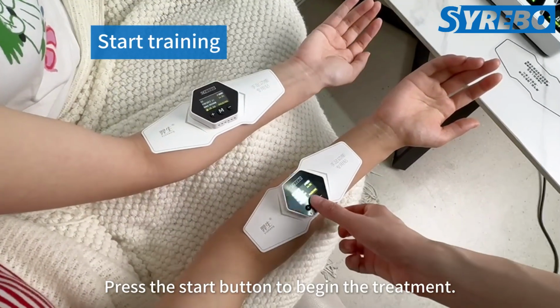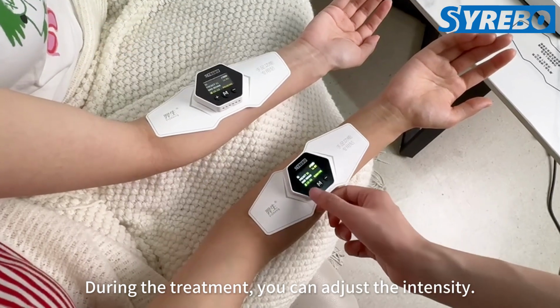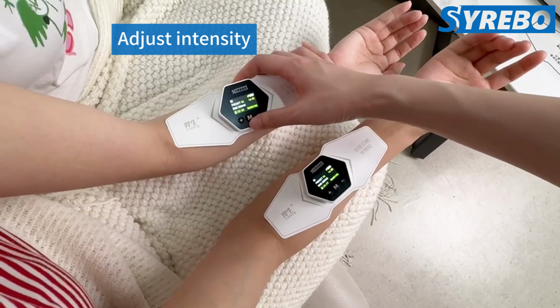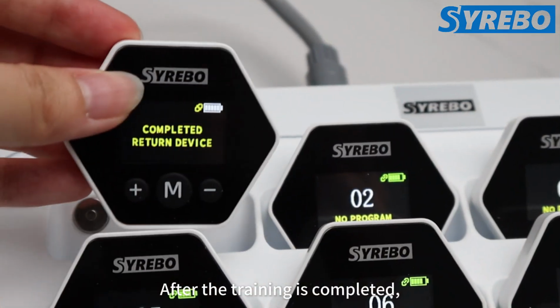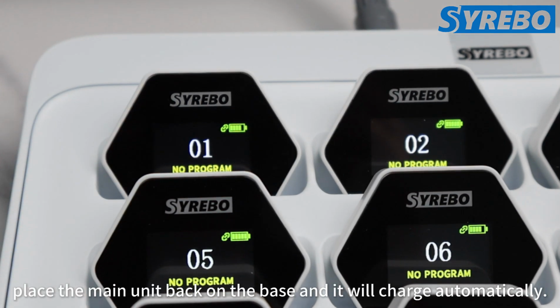Press the start button to begin the treatment. During the treatment, you can adjust the intensity. After the training is completed, place the main unit back on the base and it will charge automatically.